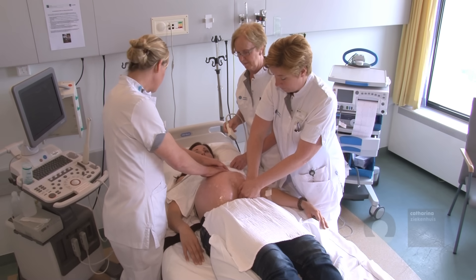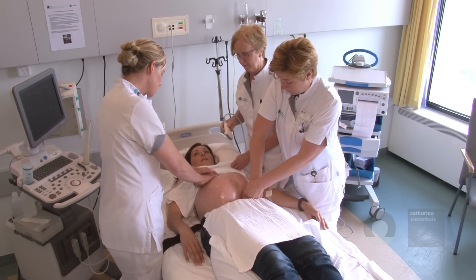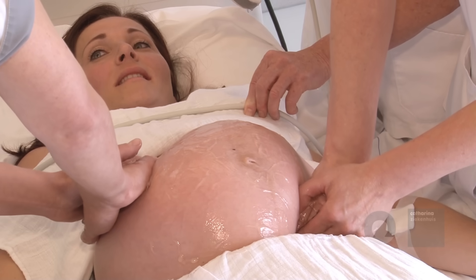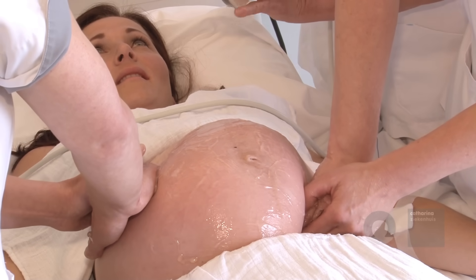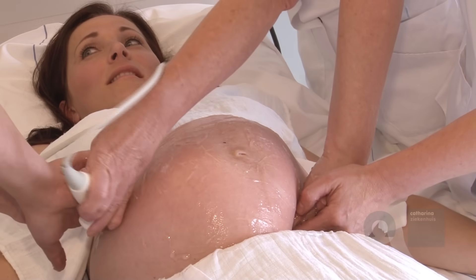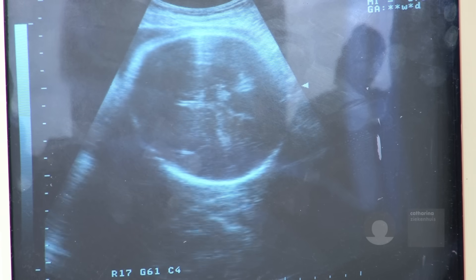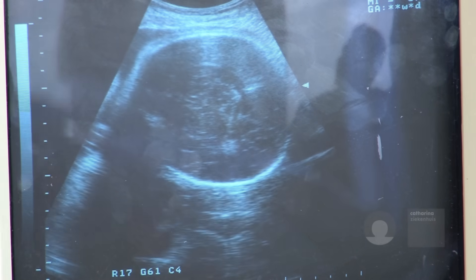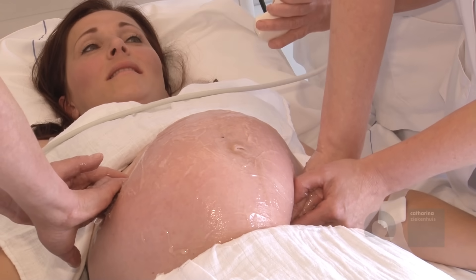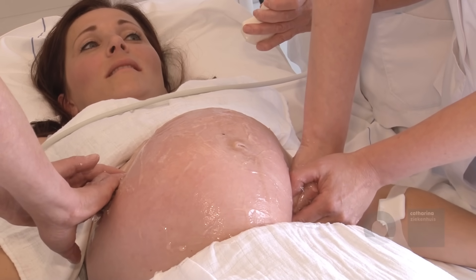The first obstetrician, focusing on the fetal head, tries to manipulate the head with a pull movement in the turning direction. In order to prevent too much pressure on the fetus, these movements are consecutive rather than simultaneous. Simultaneously, the progression of the attempt and the fetal heart rate are monitored by ongoing ultrasound by a biometric nurse. When repeating these attempts by both obstetricians, one after the other, the baby will turn.